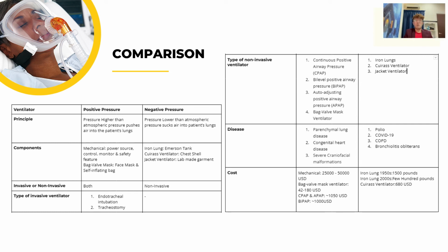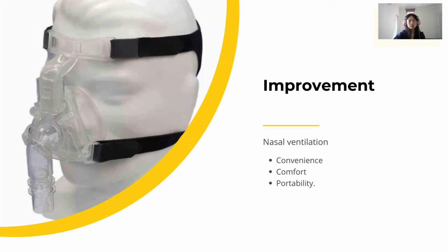I will now pass the time to Alicia, who will talk about the improvements that can be made to the ventilators. Lastly, the improvement of positive pressure ventilators. The development of additional non-invasive ventilator support systems, particularly positive pressure ventilation provided by the nose or face mask, has happened concurrently with the improvement in negative pressure breathing technique.